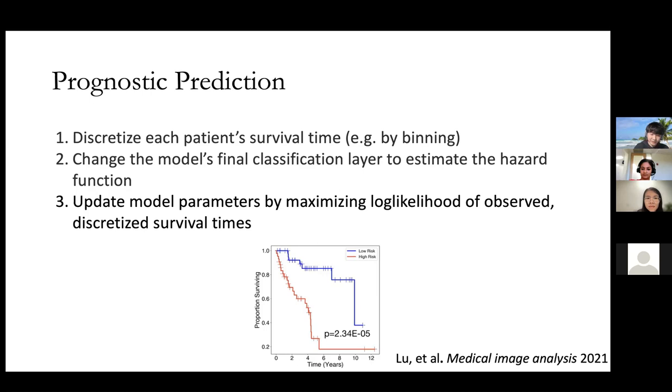For survival, one common loss function people use is the Cox proportional hazards model. But for that, you can't do it with a batch size of 1. To overcome that issue, we did a little bit of research and found this model, and it works reasonably well. So we haven't actually tried other methods for survival prediction. Yeah, I see. Thanks.